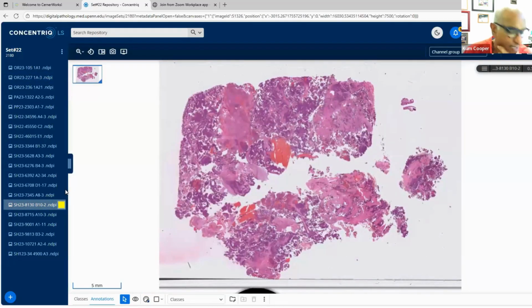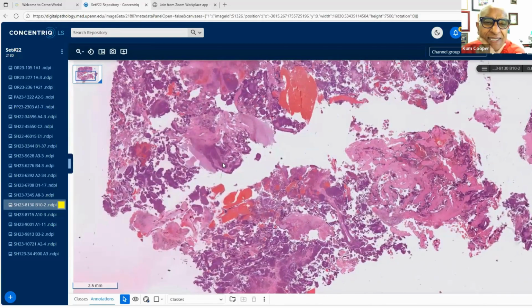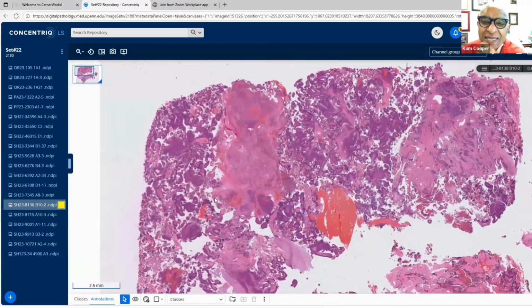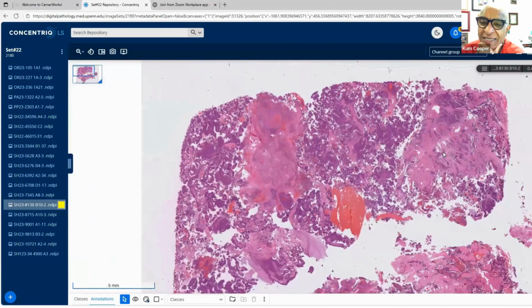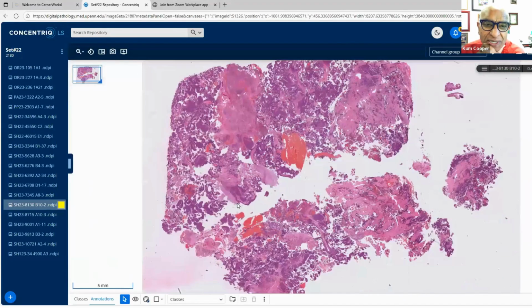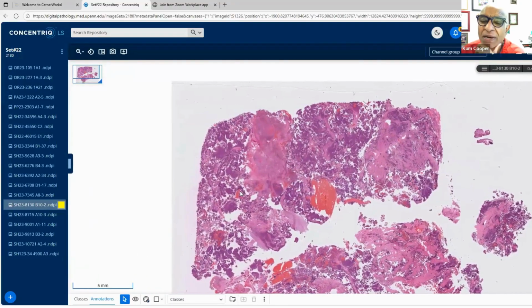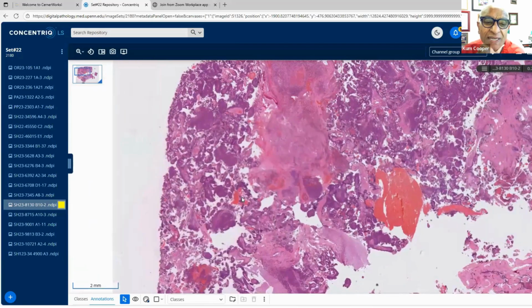All right, so this is a skull-based tumor, 66 male. And it came to the head and neck sign out. So our head and neck surgery, ENT surgeons would remove this. And you can see that the entire slide comprises tumor. There's some necrosis there and hemorrhage. But let me go down and show you the tumor itself, okay?